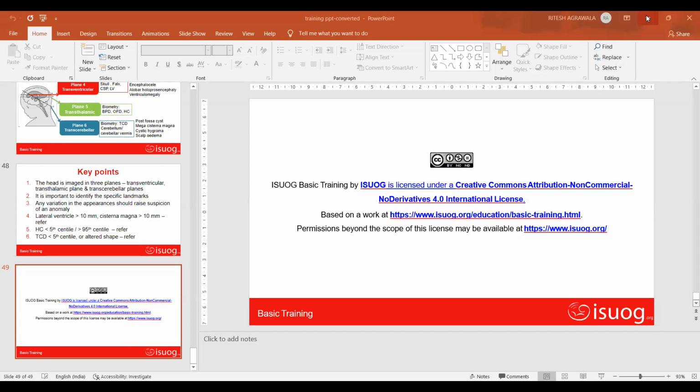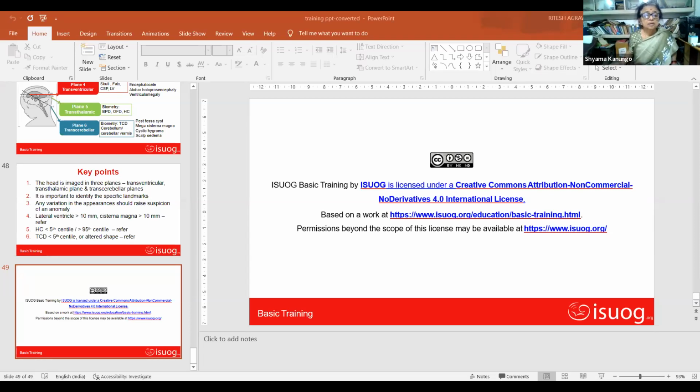Thank you very much, Professor Khurana. Wonderful elucidation and resume of Suchita's lecture. And at the outset, I would just ask you a question. Does HS40 Samsung have these centiles? Yes, it does. So you can program this to appear on the screen by going into the system utilities and switching it on. So that has to be seen.